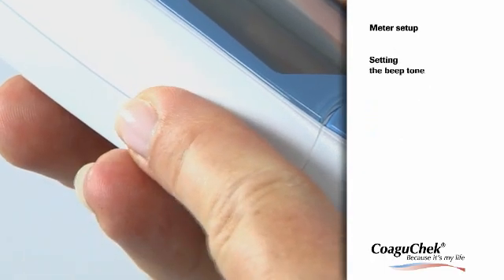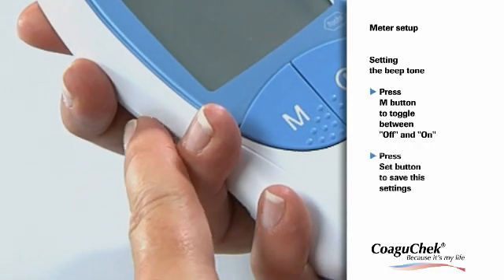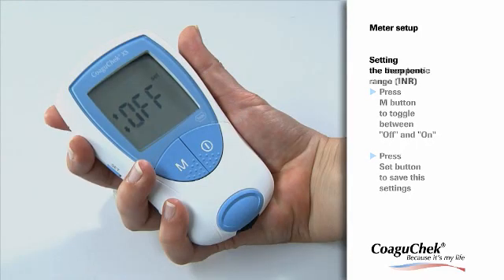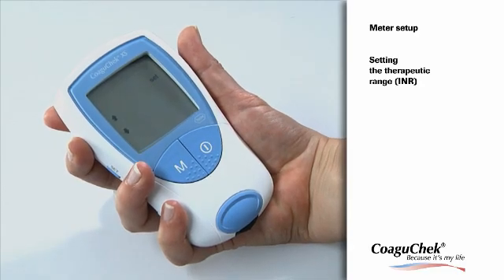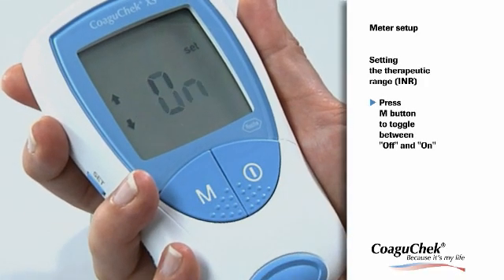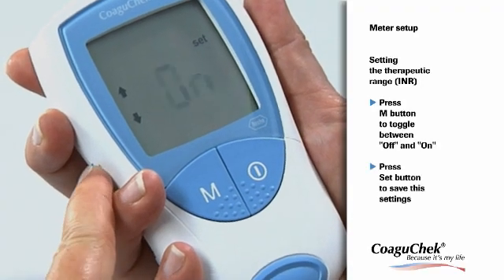Now you can choose whether you want the beep tone on or off — it is recommended to leave the beep tone turned on. Press the Set button to save your setting. The display automatically moves on to the next setting option. If you have selected the unit INR, you can now choose whether you want an additional element to be displayed that shows if the result is above or below your therapeutic target range. Press the M button to toggle between off and on, and press the Set button to save your setting.